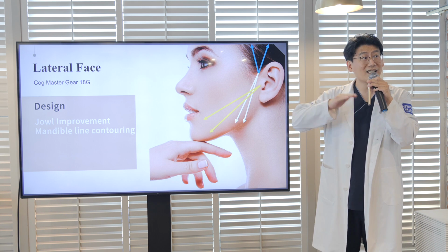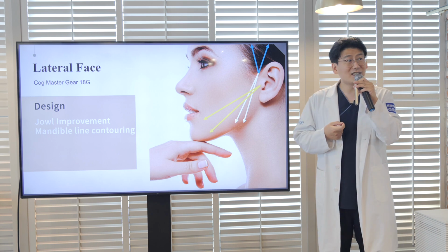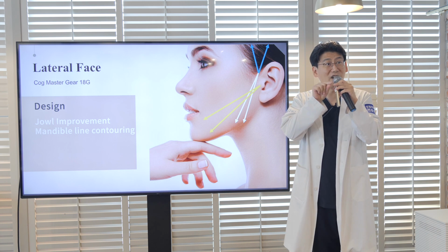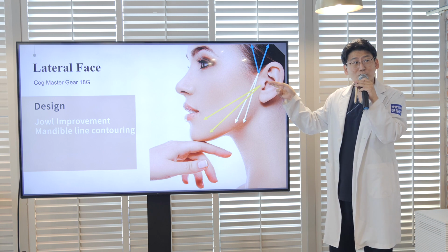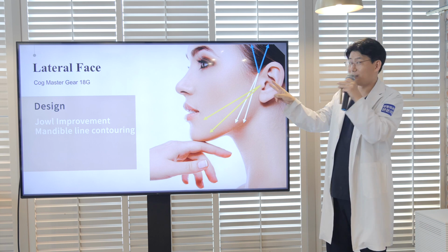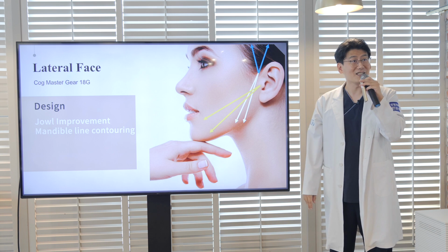Once you've accumulated experience with thick thread, for better fixation, you can tie them together. Don't forget to bury the knots into the skin. So if you insert 2 threads into 1 skin hole, you can tie them together, bury the knots, and cut the exposed part for better fixation.